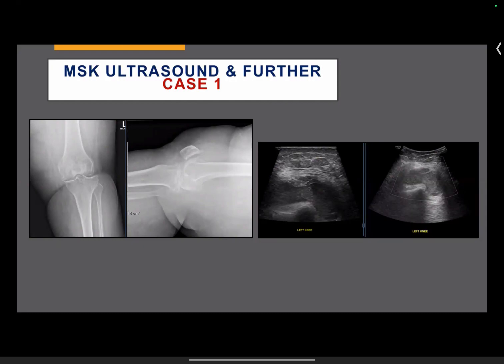So if the patient comes to ultrasound, what next to do, right? This is a patient who has got tricompartmental osteoarthritis with some erosions there. You do an ultrasound, worsening pain, but look at the fluid there. It's not clean fluid, right? With not much vascularity though, right? Okay. But the patient's CRP is up, she's got a UTI or things like that. And then this doesn't look right.